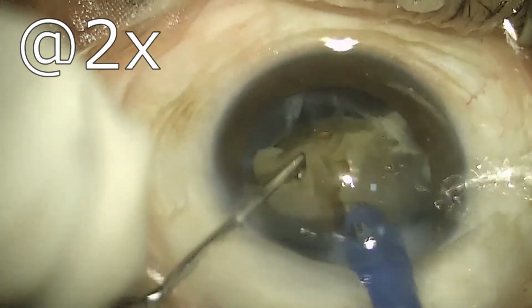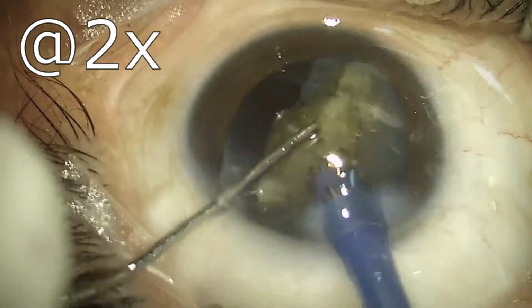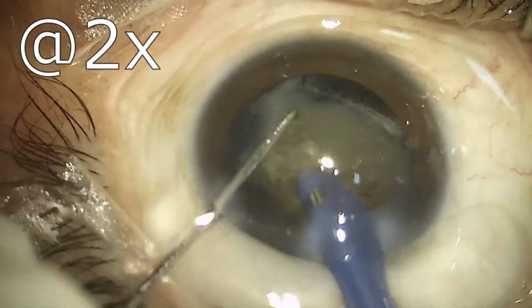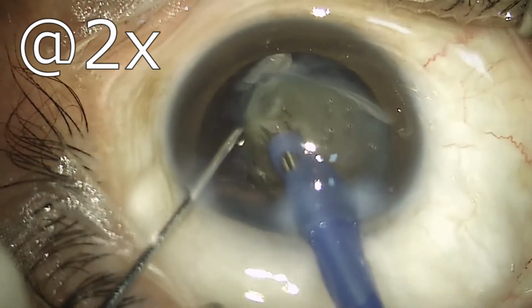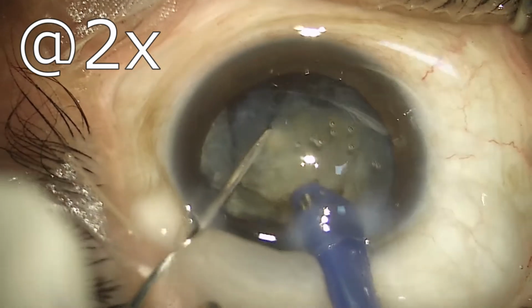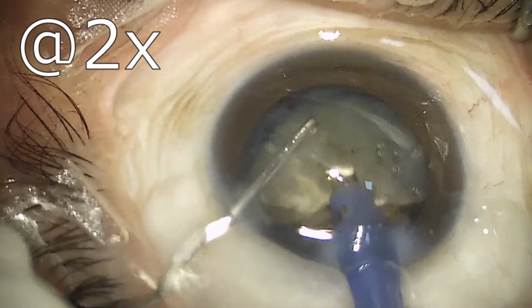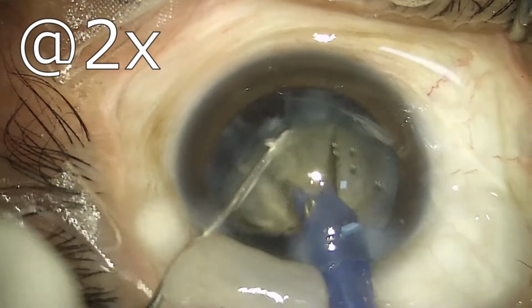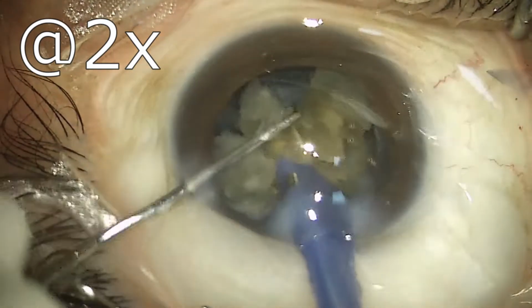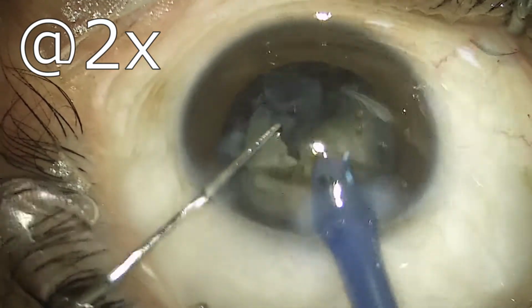Half of the nucleus has been emulsified, and now this is the important thing which I want to demonstrate, that the nuclear pieces can be disassembled from any particular side or plane, whichever is feasible for capturing using the phaco tip. Larger pieces can be chopped and re-chopped again and again, making it easier for the phaco probe to consume them.